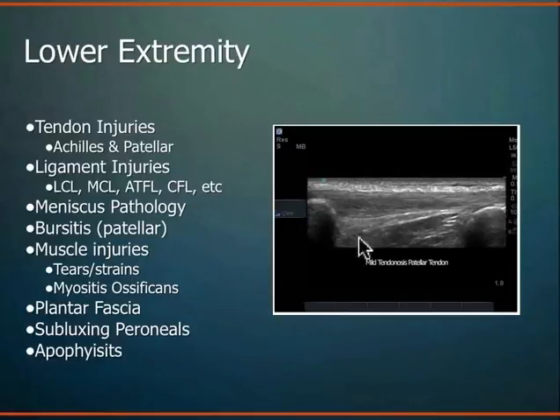This is that retropatellar area where you have the fat pad and a bursa, and you can see the anatomy quite well. You can see the LCL quite well. You can see the MCL quite well. You can't see the ACL or PCL. Again, those are limitations of your modality and knowing what you can use it for. But you can see it for the meniscus, and around the ankle you can visualize those peroneal groups, the ATFL, anterior talofibular ligament, all the common ligamentous structures that you see in your common ankle sprains. All these bursal sacs tend to be very superficial, and you can image those quite well. And again, muscle tears, muscle strains, full ruptures, hamstring tears, a very, very common injury in sports, you can see quite well on ultrasound.